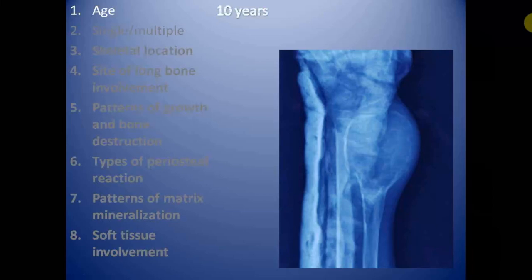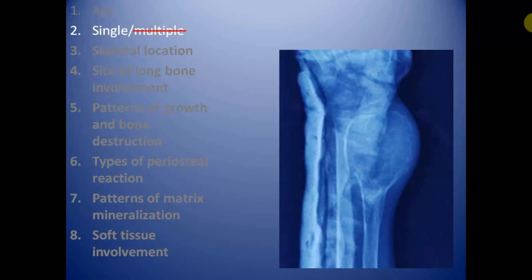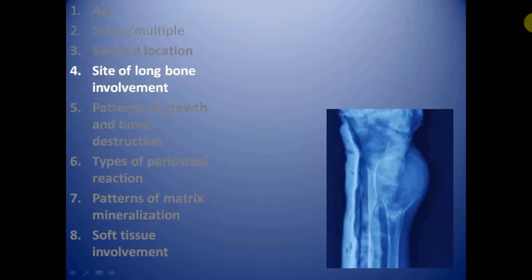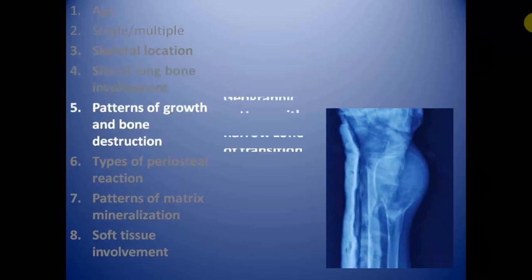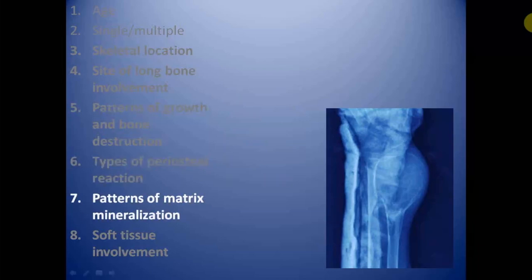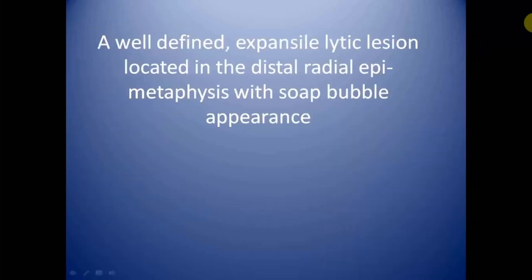Age of the patient is 10 years — a young child. The lesion is single, involving the distal end of the radius. Skeletal location is appendicular, involving a long bone. The lesion involves the epiphyseal and metaphyseal region of the distal radius and is expansile in nature. It shows a geographic pattern of bone destruction with a narrow zone of transition. The periosteal reaction is non-aggressive. There is no obvious cartilaginous or osseous matrix, but there is a typical soap bubble internal appearance. There is no obvious soft tissue involvement.